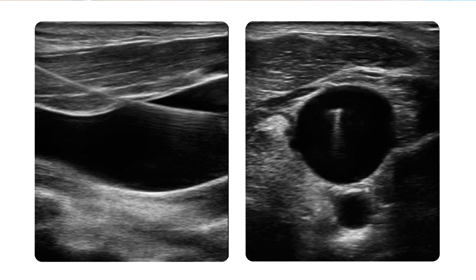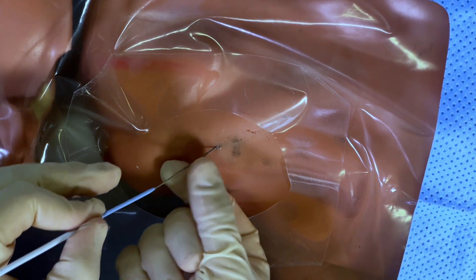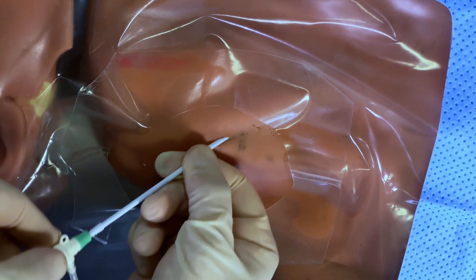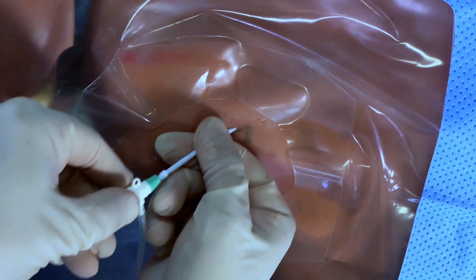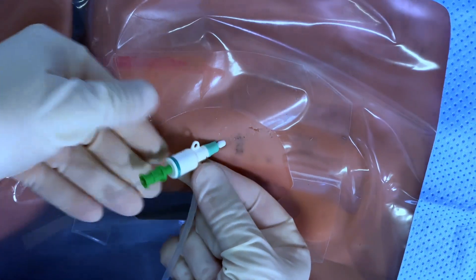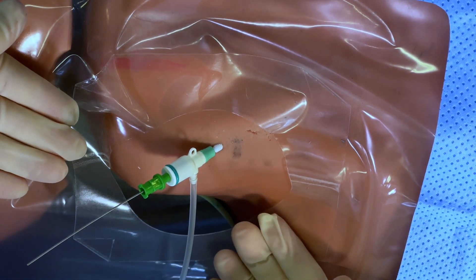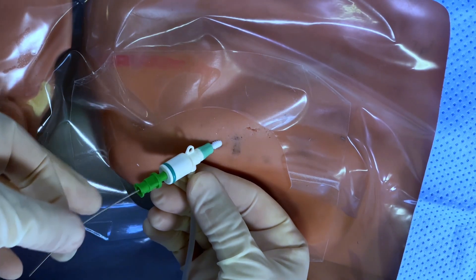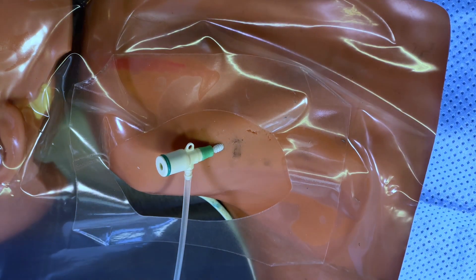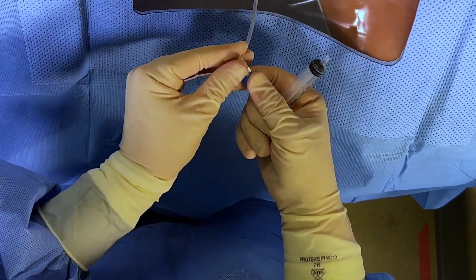Using standard Seldinger technique, place the sheath, advancing the sheath and the dilator as a single unit over the wire until the sheath is hubbed. Stop immediately if there is resistance. Withdraw the wire and the dilator as a single unit from the sheath. Once all that remains is the sheath, aspirate blood to confirm placement.